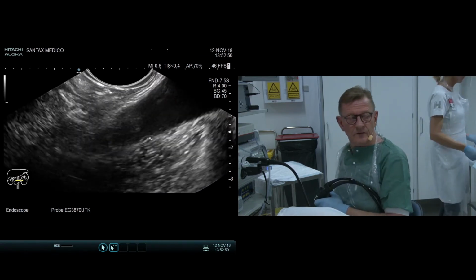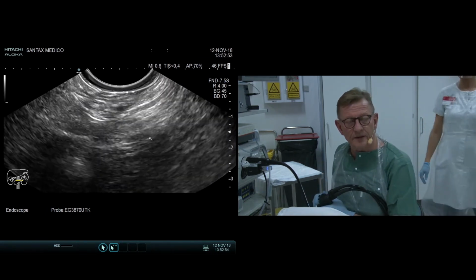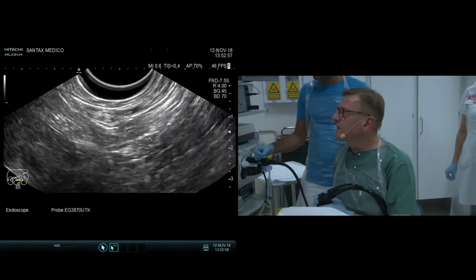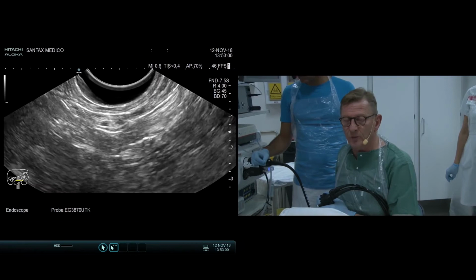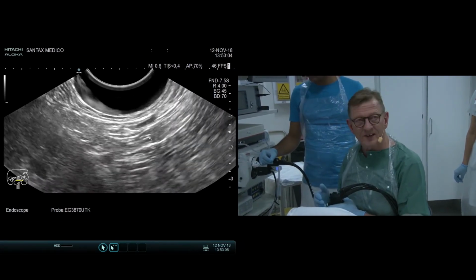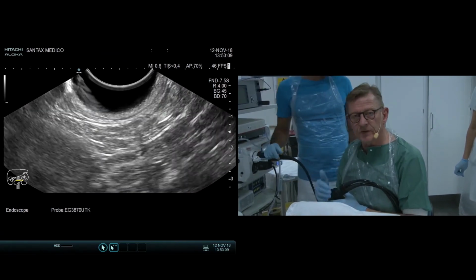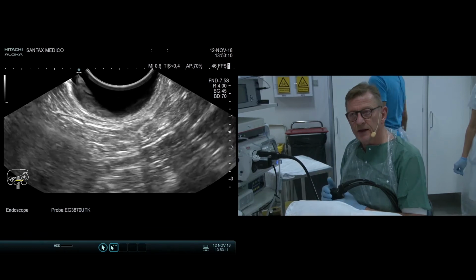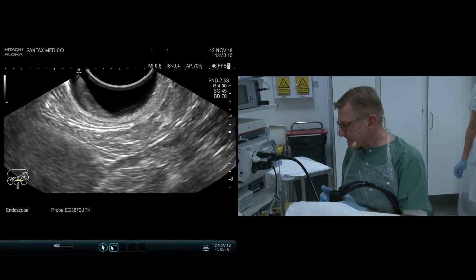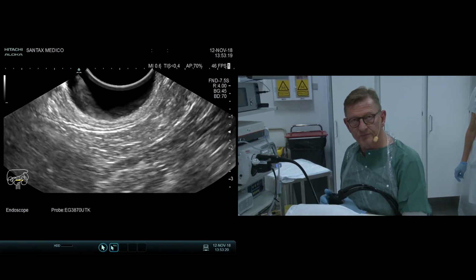Okay. Are you using antibiotics, Peter? Do you use antibiotics as a prophylactic measure in all the cysts? We do antibiotics in all our patients, and we also do Ringer's lactate, which is, there's no evidence for this here, but there is evidence for ERCP. And we also give the patient rectal NSAIDs.